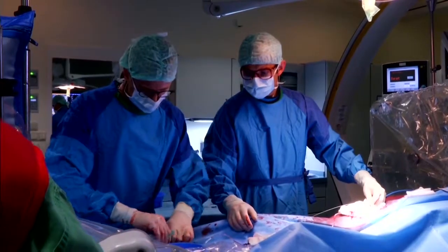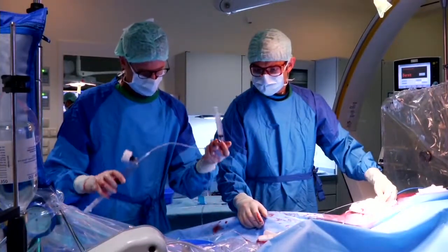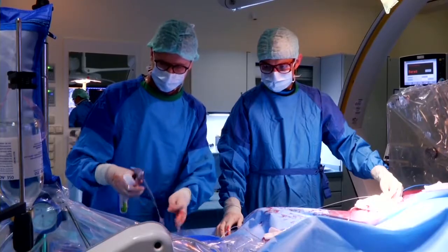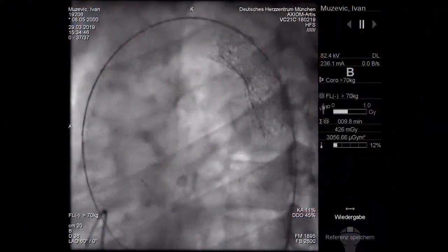Okay, so yeah. I think we align this stent a little bit more and then do the pressure measurements, okay? So the bib balloon you mounted that on was 16 or 18? 16, yeah, right. And I'm quite happy that this first stent was easily dilatable. I hadn't thought this.